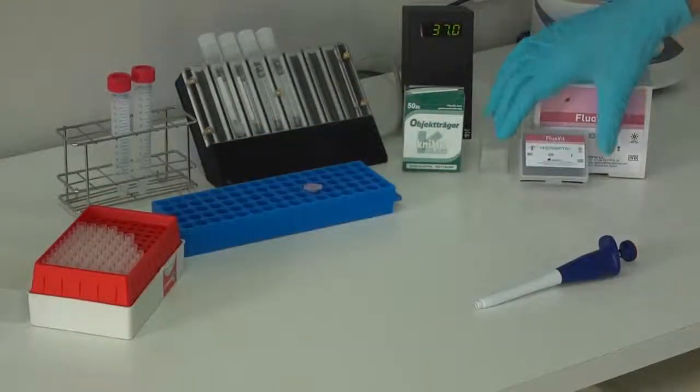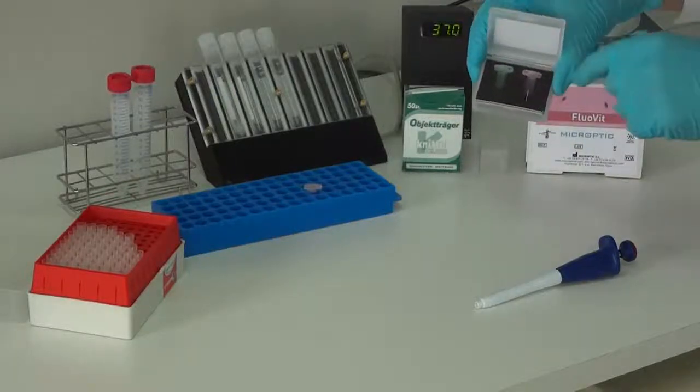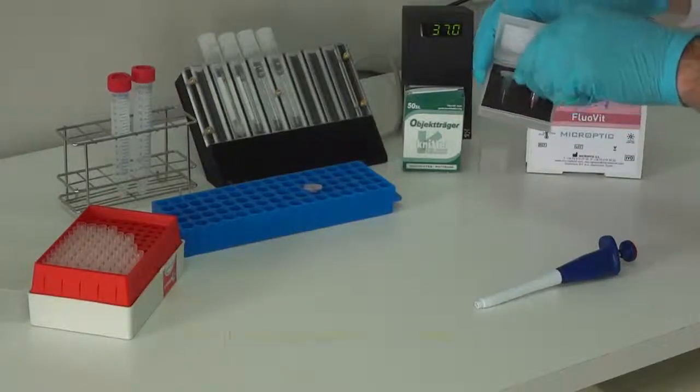Take off the Eppendorf from the incubator and add one microliter of red Eppendorf stain previously heated at 37 degrees centigrade.